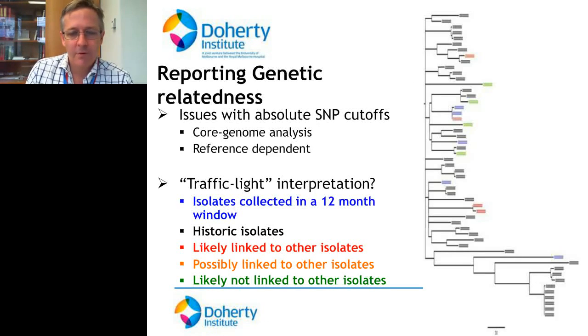So how do we report then? Well, this is a challenging part of transitioning to genomics, because we are reporting to epidemiologists who need to use this data to investigate potential common source outbreaks. And they're used to having binary type data, i.e. particular names or numbers given to certain typing results. So they might be used to a particular PFG group or a particular serotype, for example.